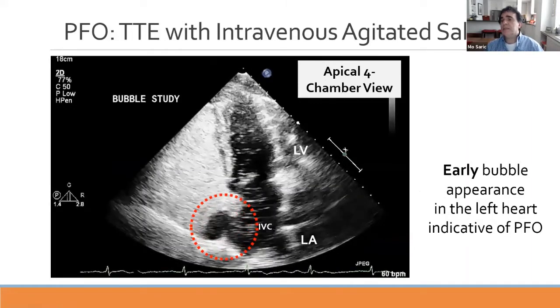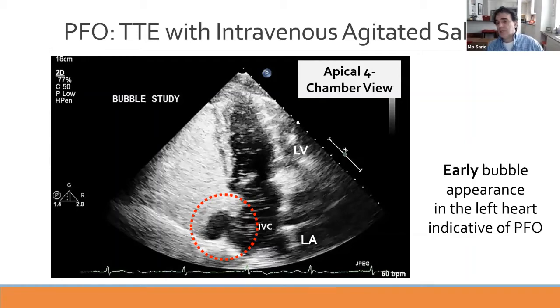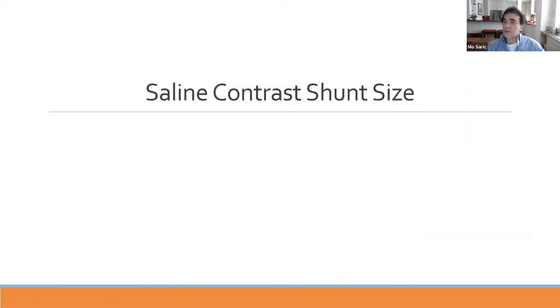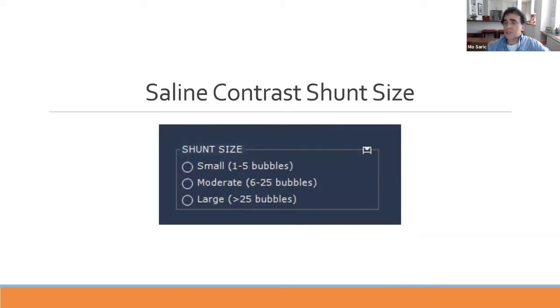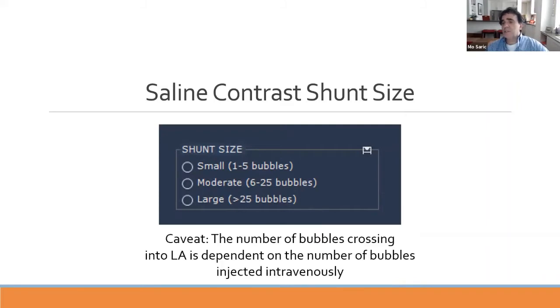This is a frozen image. You often see negative contrast in the right heart because the injection is done through the arm, so bubbles come through the superior vena cava while the inferior vena cava remains bubble-free, creating an echo-free space in the right atrium. The size of the shunt can be quantified: one to five bubbles is small, six to 25 is moderate, and more than 25 is large—though the number depends on the volume injected.